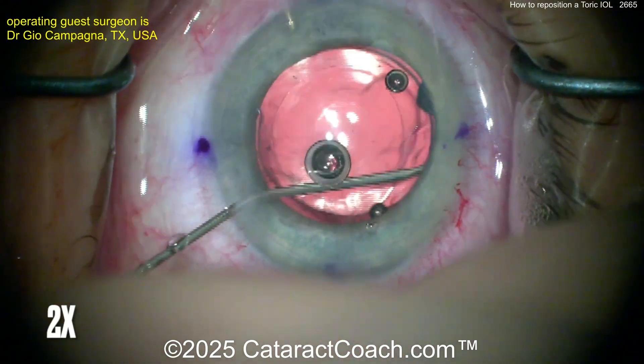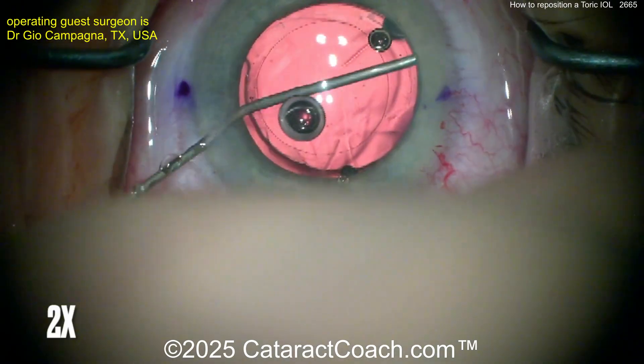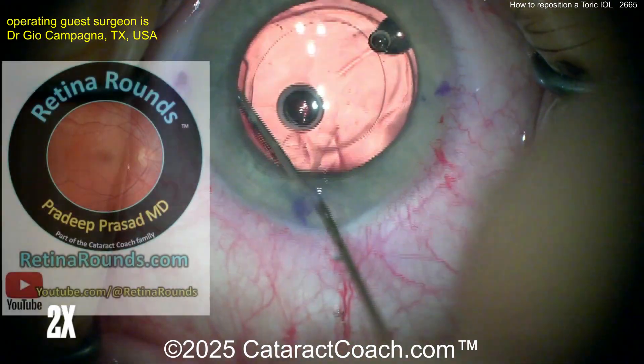Some surgeons, if it's really in the close post-op period, will reposition this lens without using viscoelastic. We've had videos of that in the past too.